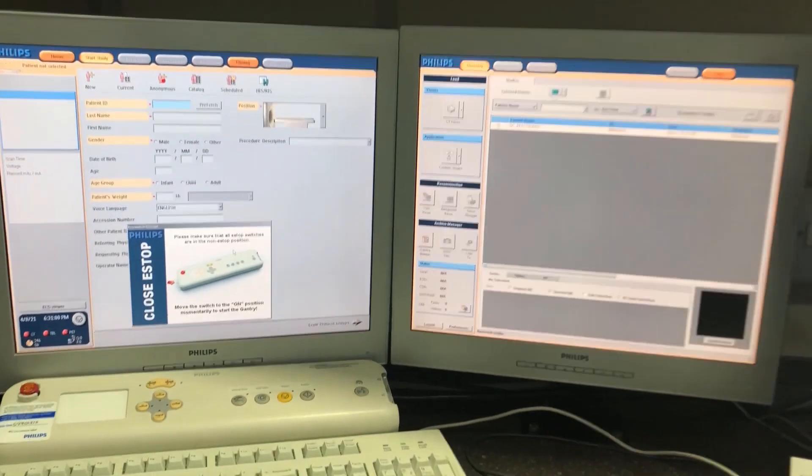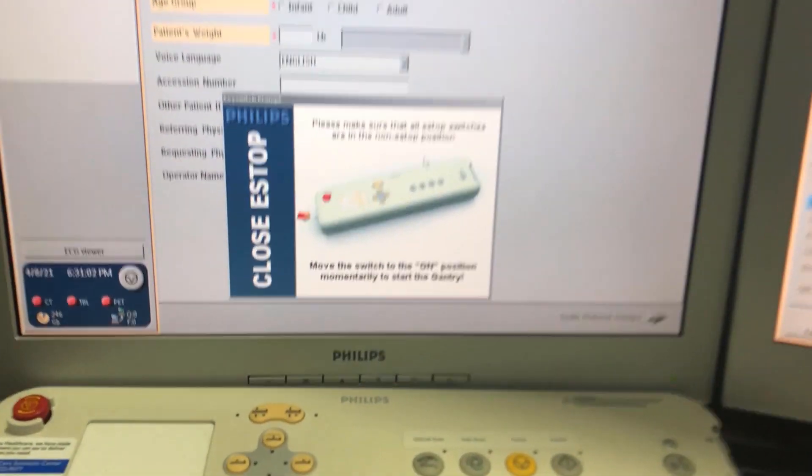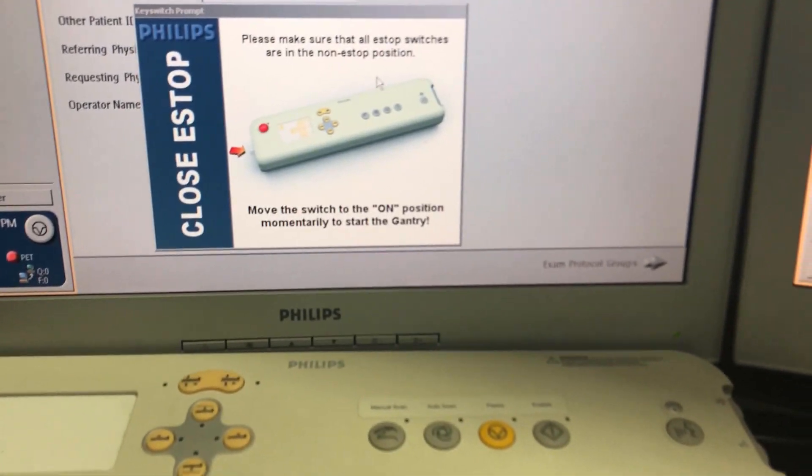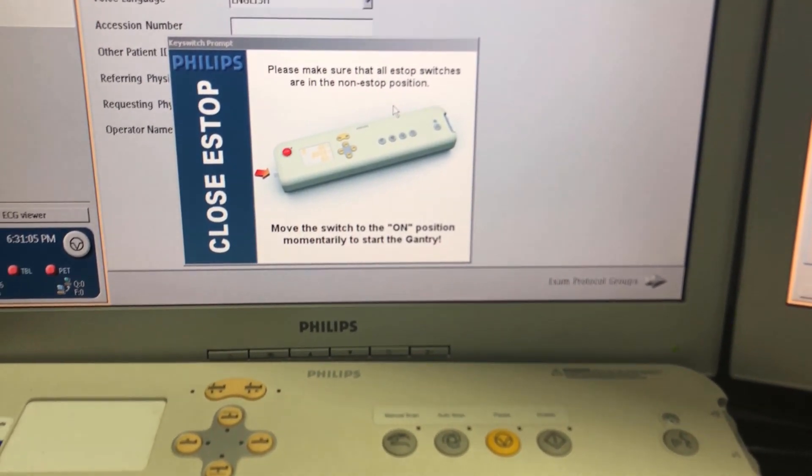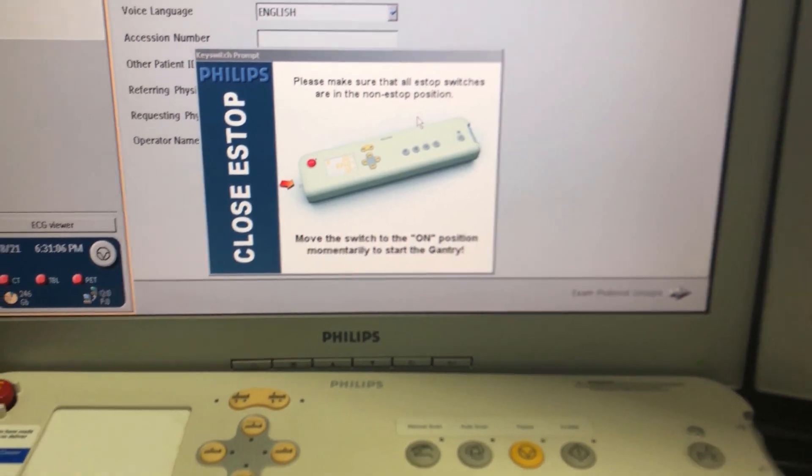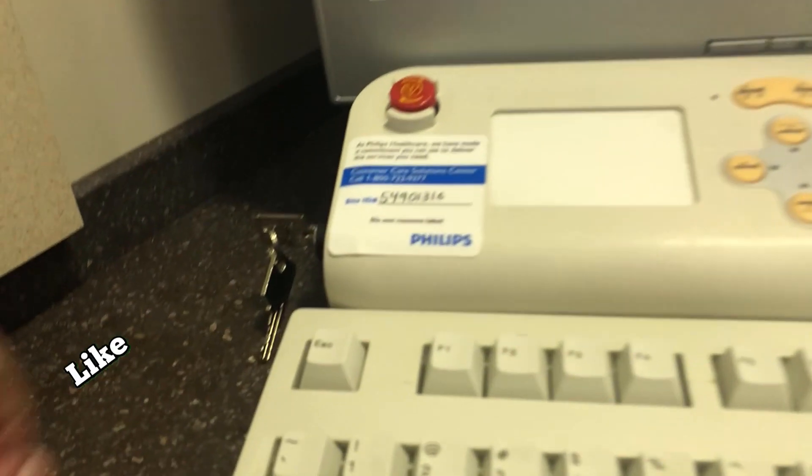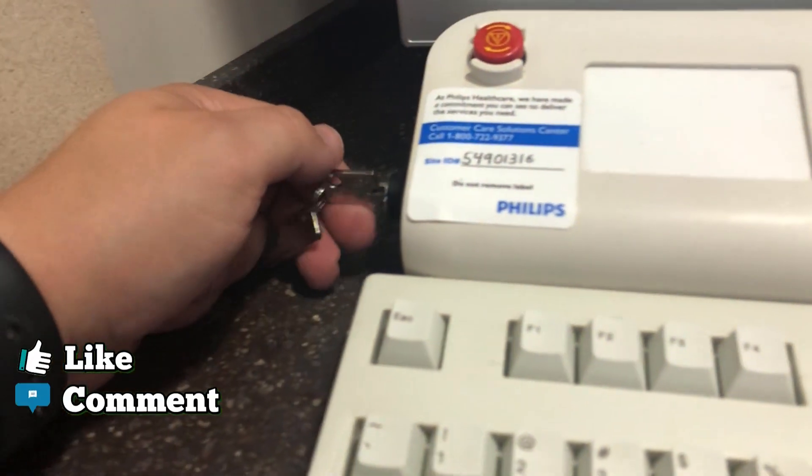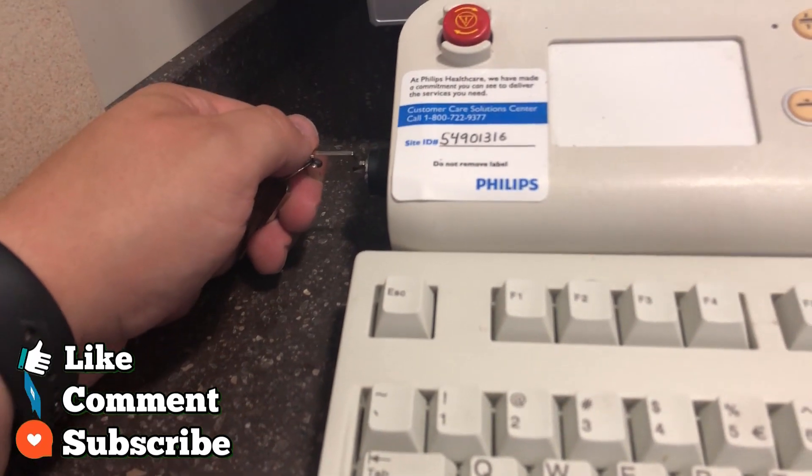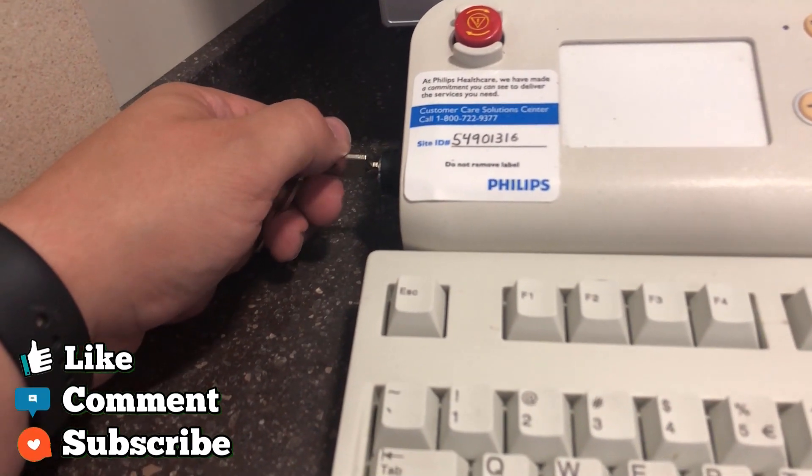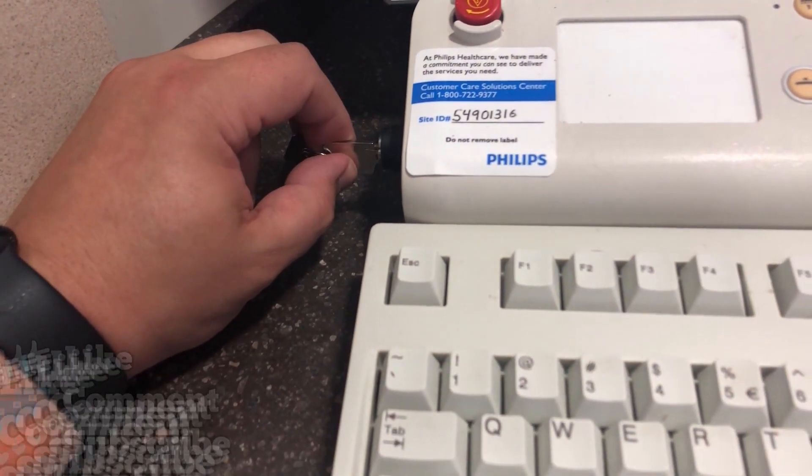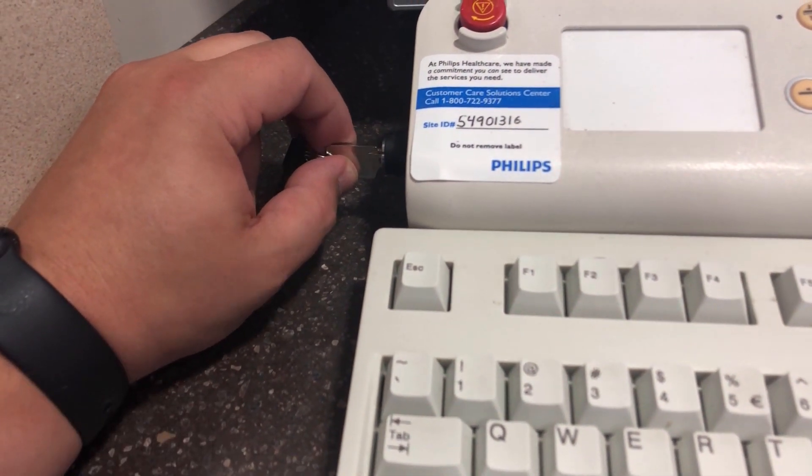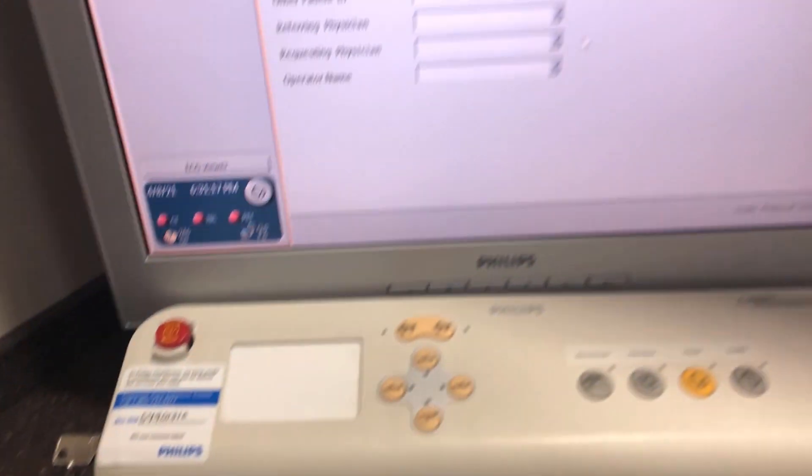Okay, so once everything has booted up, you're going to have this little box. It says you need to close the e-stop. So we're going to come over here. We're going to turn it from the off position to the start position. You'll hear a click.